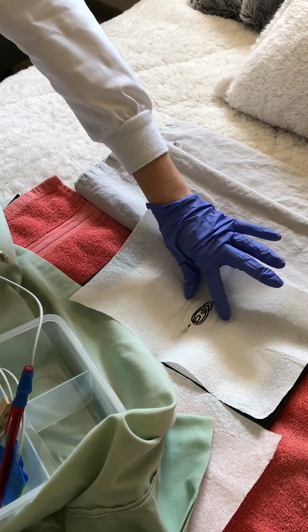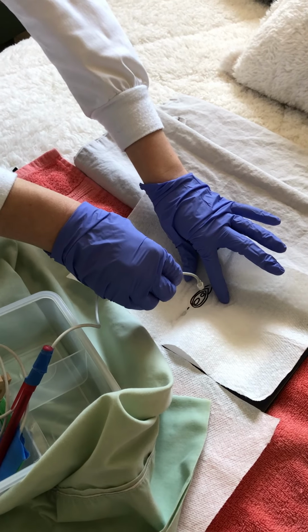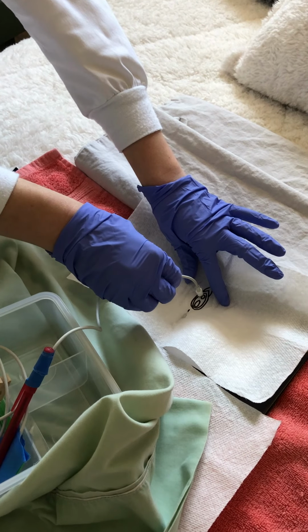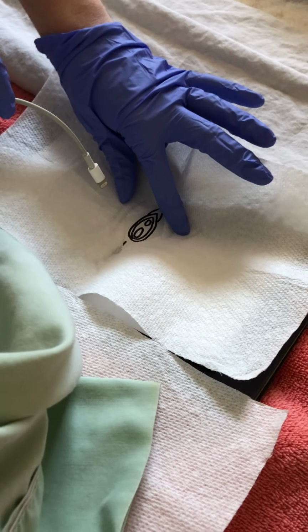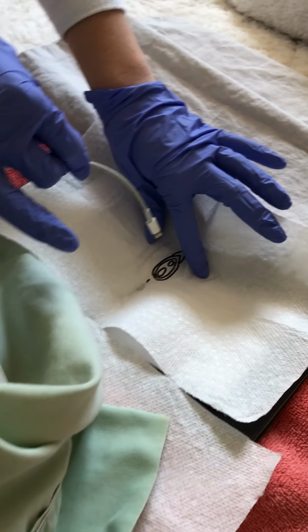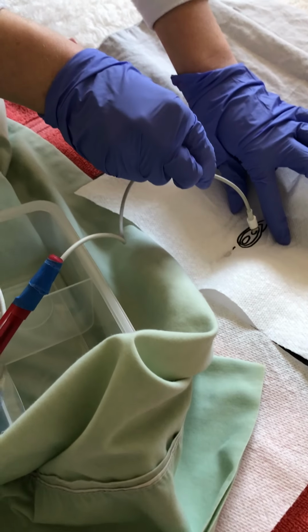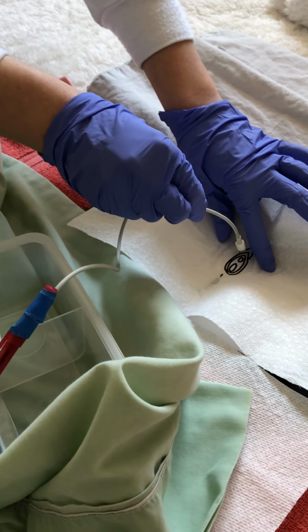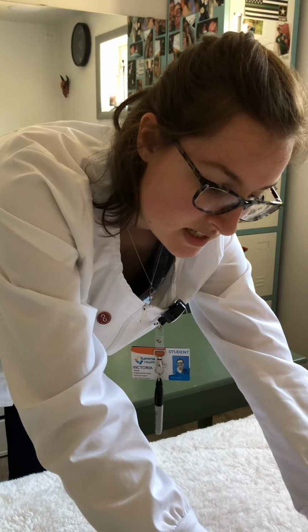I'm going to spread the labial folds, and I'm going to tell the patient to take deep breaths and just relax, and I'm going to insert that catheter about 2 to 3 inches, and watch for urine to drain into that receptacle bag. Once it has drained completely, I'm going to insert that catheter about another 2 to 3 inches. You don't ever want to force the catheter through the urethra. You don't want to cause any damage.